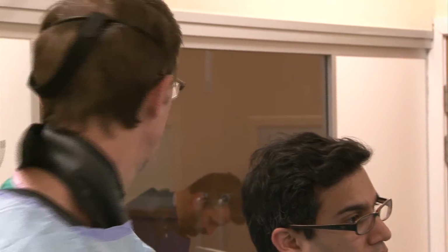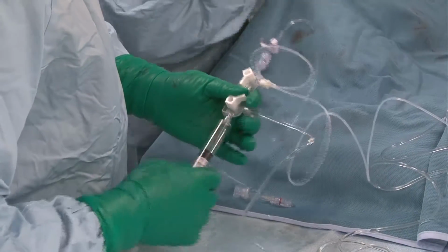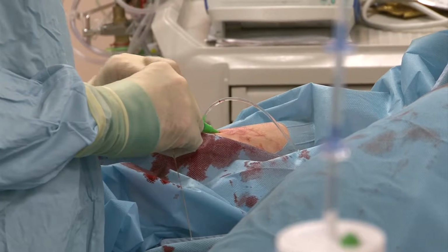Both sheaths are flushed with saline, which is salty water, to stop clots forming within them. Here you see the manifold being set up so that both pressure can be monitored and contrast injections given intermittently during the procedure.